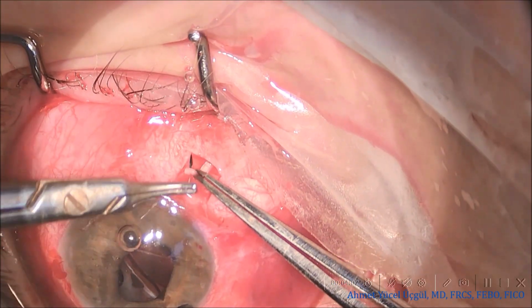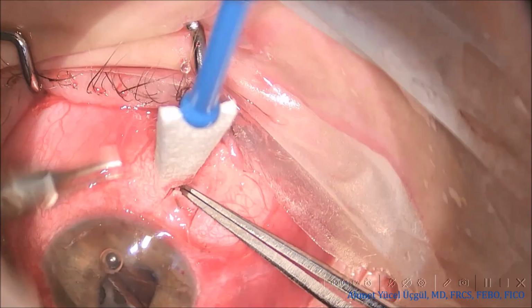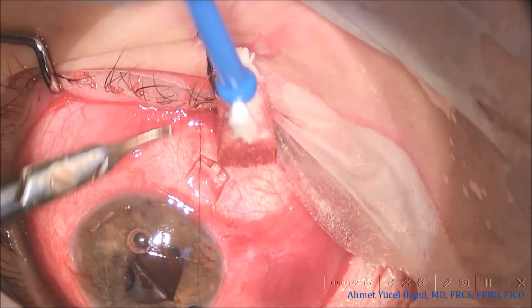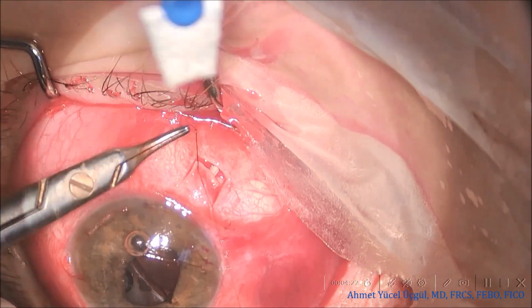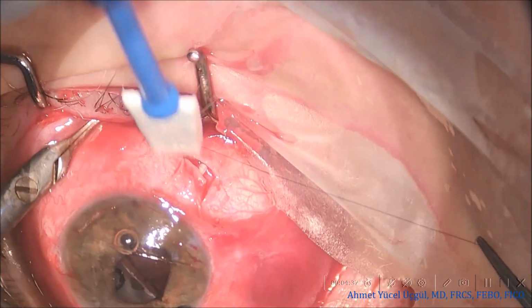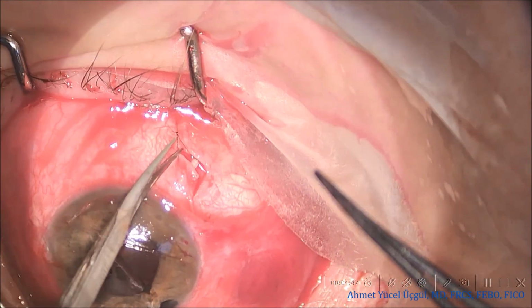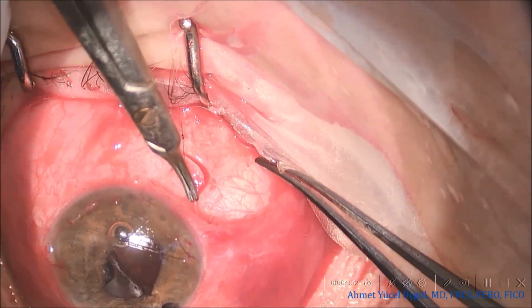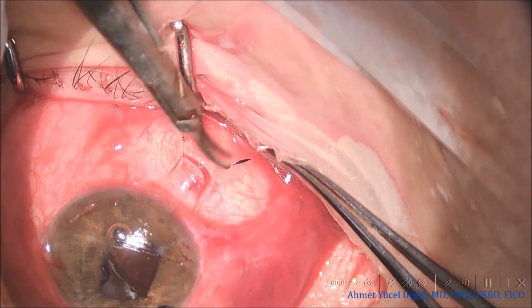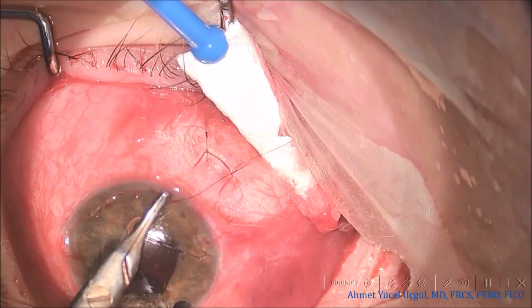The scleral flap is then closed in a manner similar to the previous case. Here, however, I use 3 10-0 nylon sutures instead of 2, adding an extra suture at the flap apex to ensure complete closure and more secure coverage over the tube. My goal at this stage is to achieve a watertight and stable flap closure. Unlike the PGI case, a Ripcord suture is not required here because the Ahmed device already contains a valve mechanism.